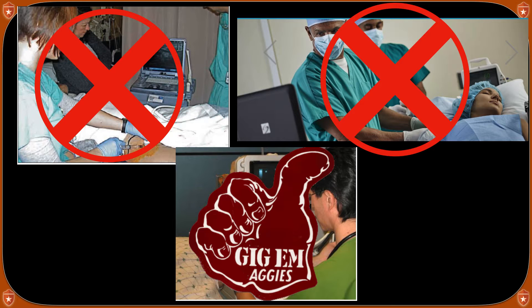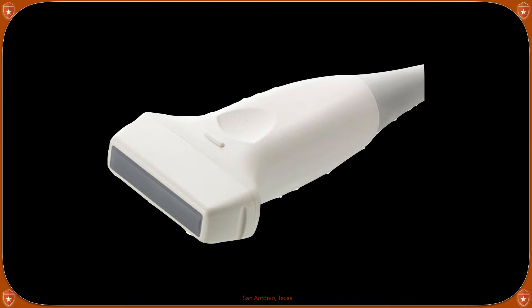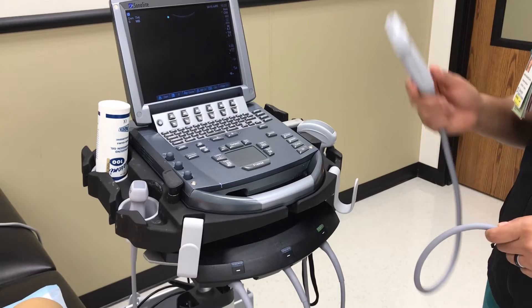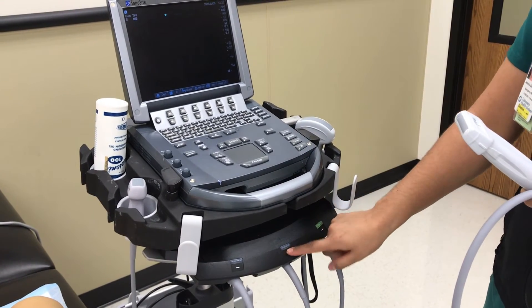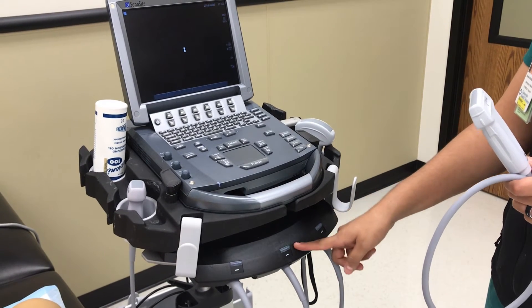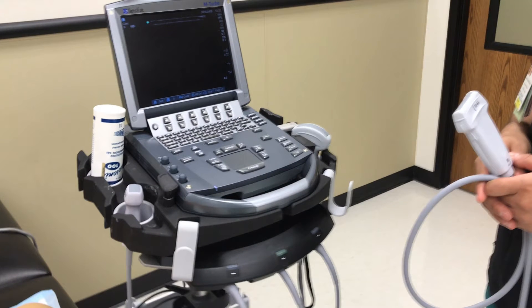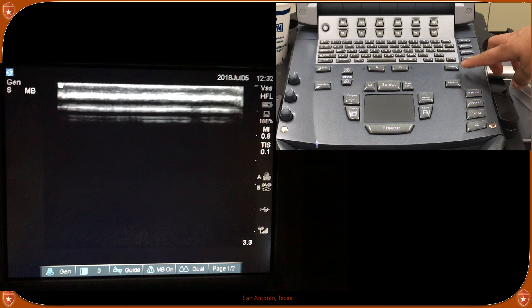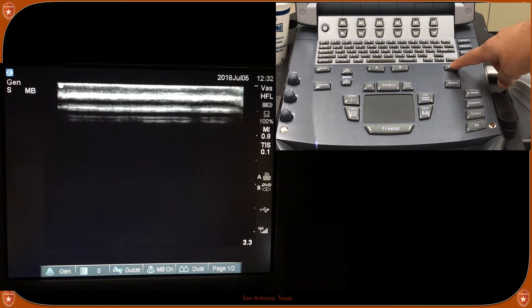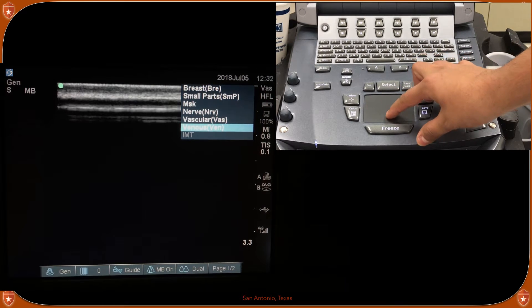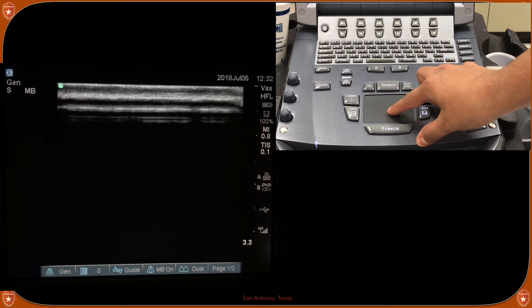Now let's talk about what probe to use for central line placement or a peripheral IV. We want to use the linear probe — a higher frequency probe that brings out the definition of superficial structures including veins, arteries, and nerves. On the m-turbo, select the button where the linear probe is connected, indicated by the green flashing light. Once you select the appropriate probe, click the exam button and bring up the vascular preset, which enhances vessel definition. Select it using the mousepad.